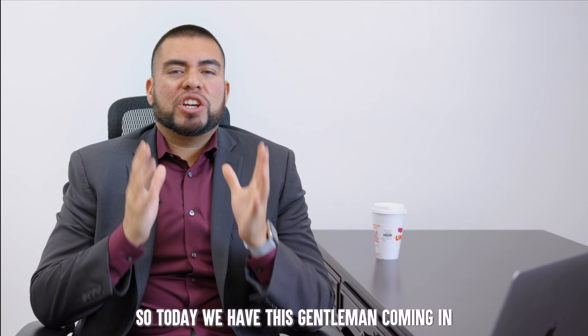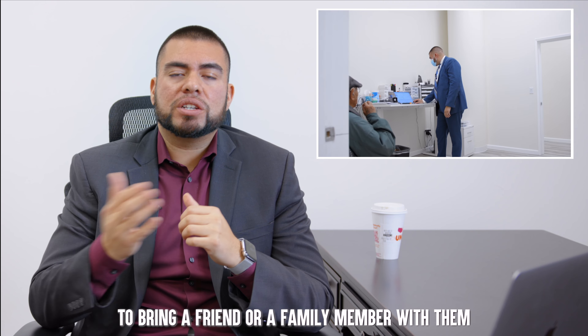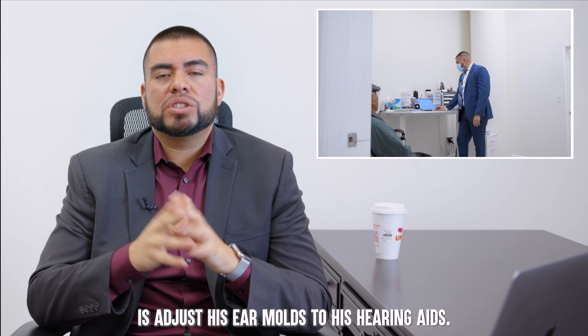Today we have this gentleman coming in for his hearing aid fitting and he brought his wife along, which is always great. I always recommend to my patients to bring a friend or a family member to help with the counseling. The first thing we're going to do is adjust his ear molds to his hearing aids.